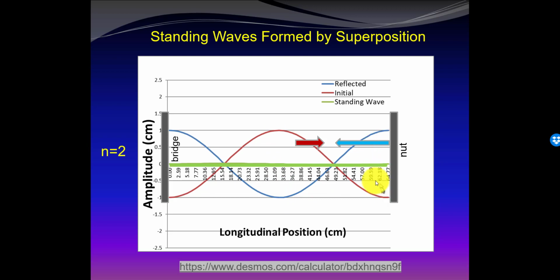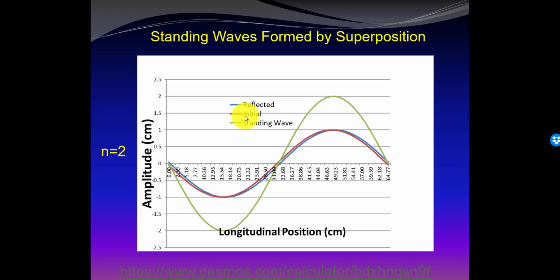So when they add up together, the positive and negatives cancel and we get a null wave. There is no wave at this moment in time. But if we wait a little bit longer, these two waves have moved and it is possible for them to overlap, for example, here and here. And the net result now is a standing wave with a negative lobe and a positive lobe.